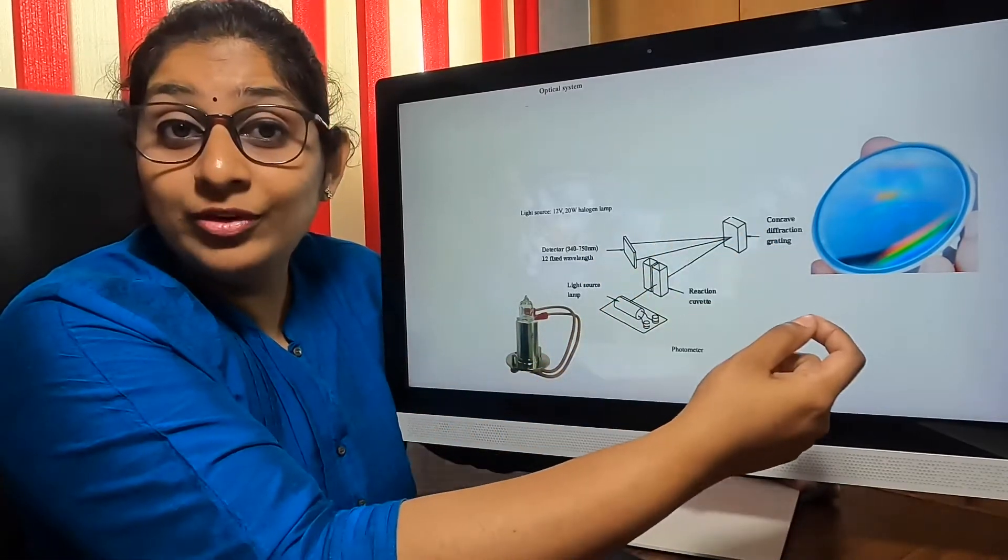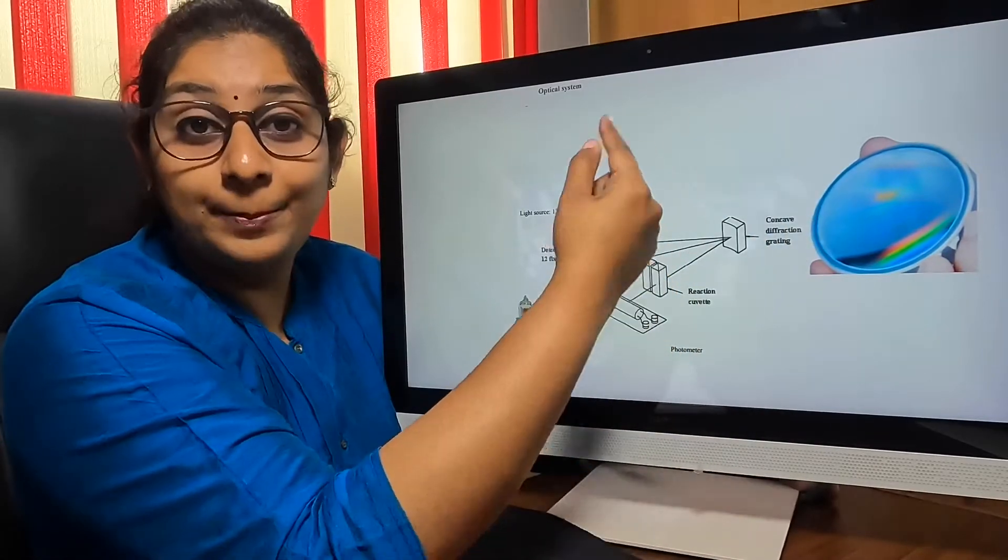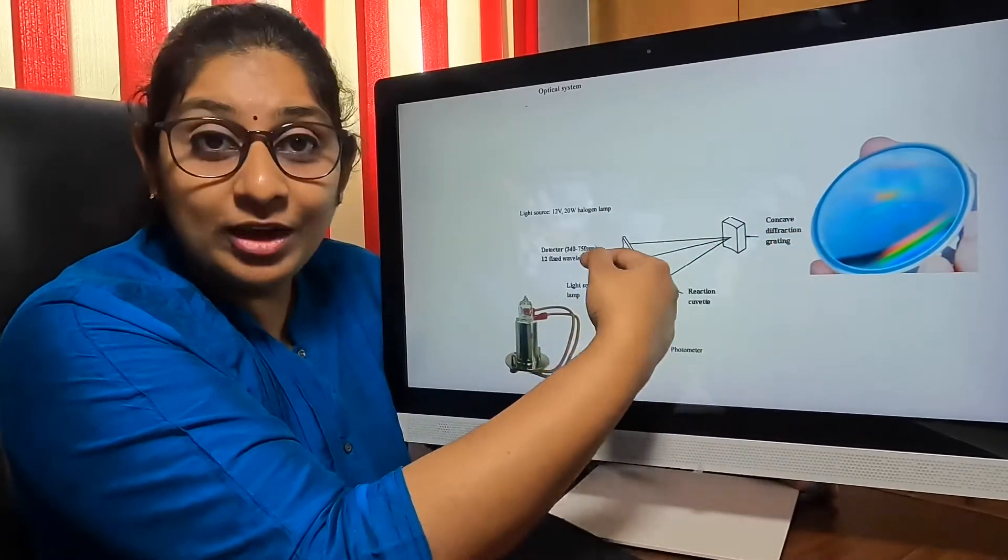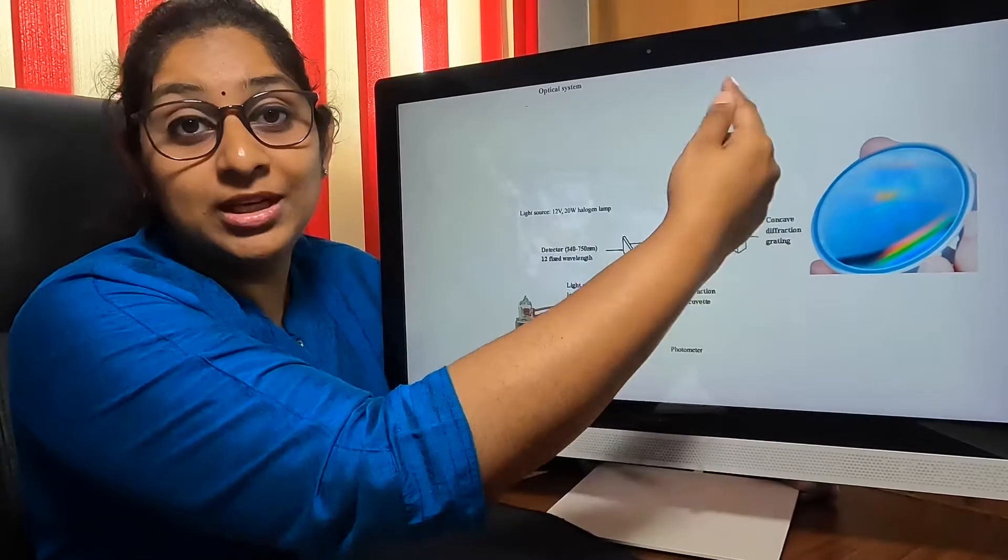Up to 750 nanometers, we will have 12 detectors placed and whatever wavelength the light is coming, it will be captured in that.